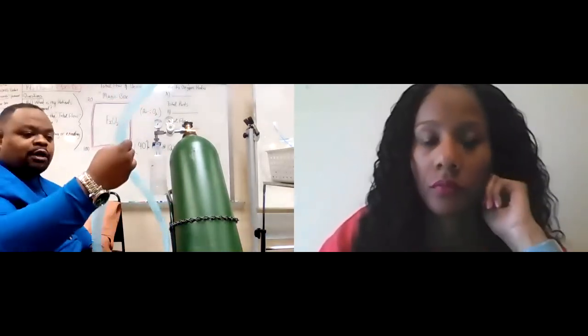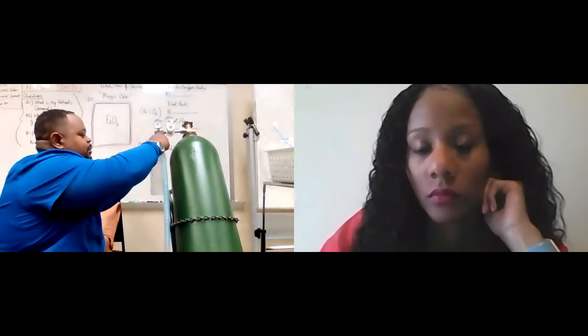All right, so after I do my large volume nebulizer, the next thing is my large bore tubing. You have to have two sets of large bore tubing. This is the first one, all right? So I got one large bore tubing, goes on here. I don't know if y'all can see that mist coming out. All right, that's the first large bore tubing.